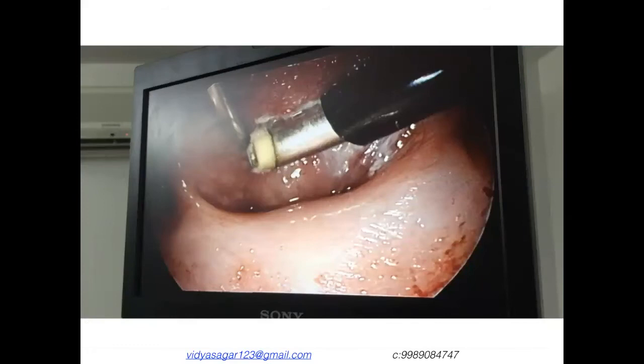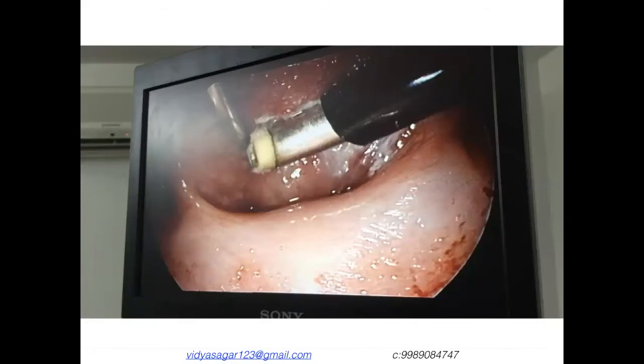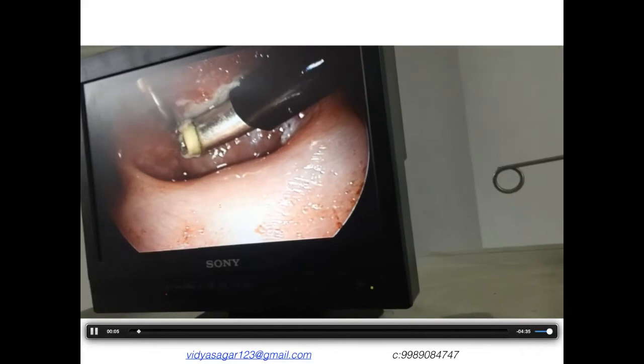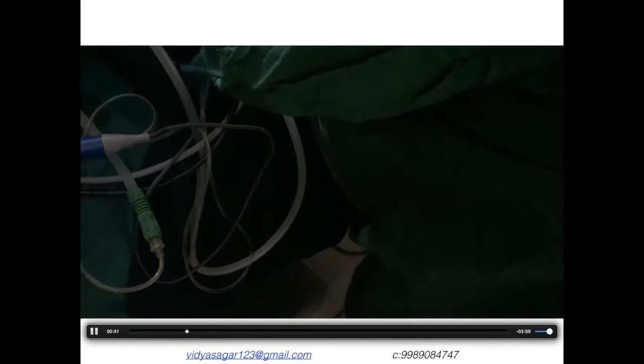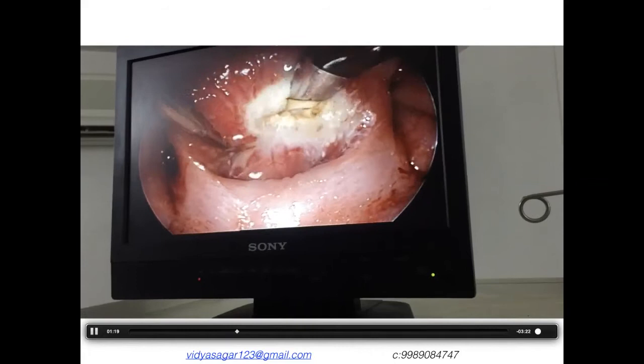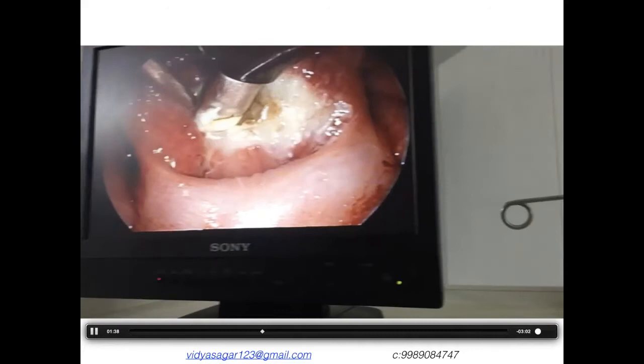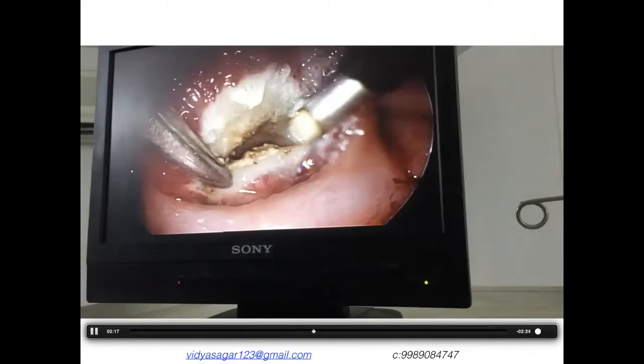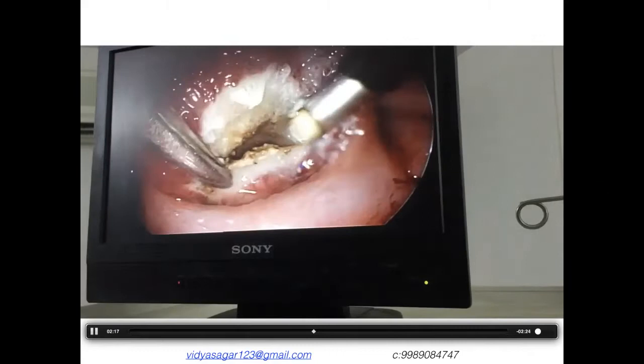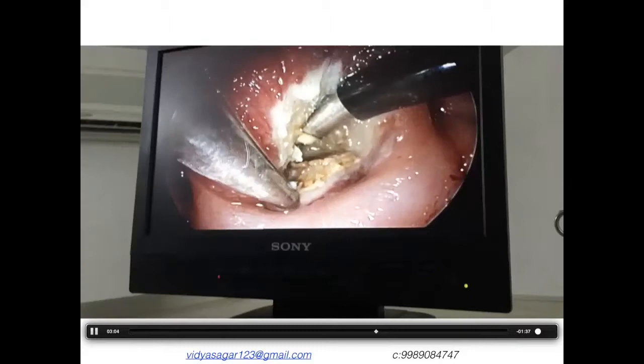Once the tongue tissue was pulled out, the assistant held it with the suture. You can see in this unedited video how the tongue tissue collapses inward with almost no space — this is a day-one child. With the coblator we created a plane between the lesion and normal tongue tissue so we could grasp with Allis forceps for traction and counter-traction to get into the tongue base musculature.